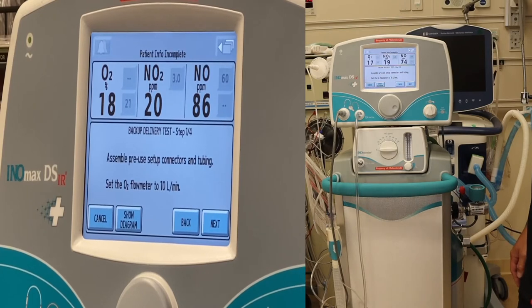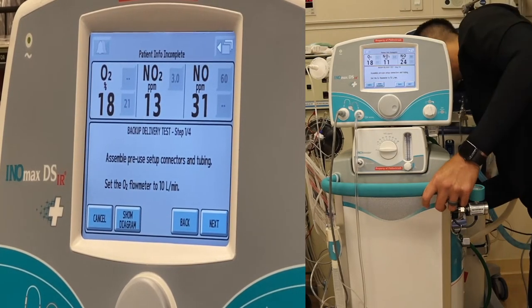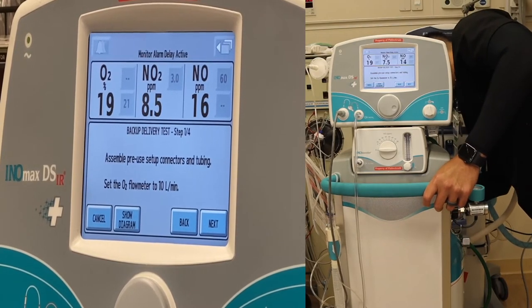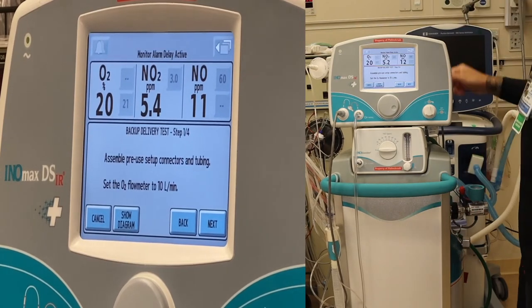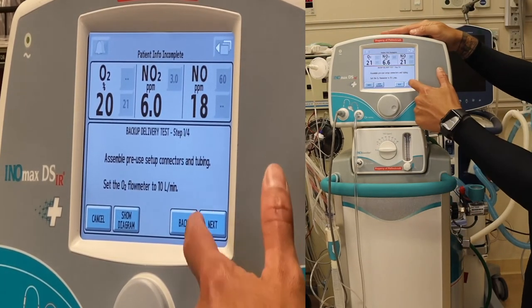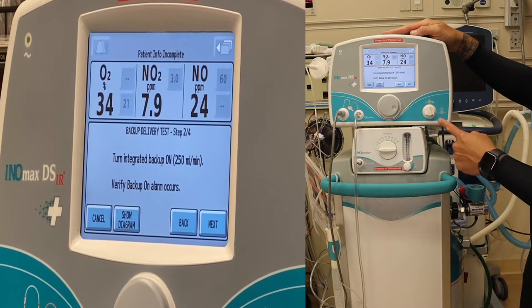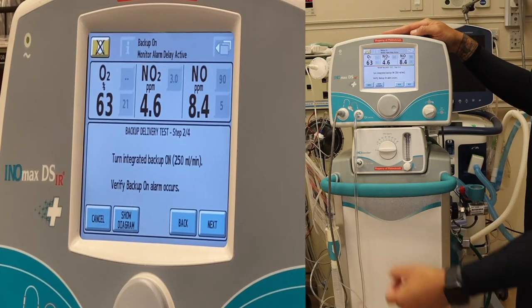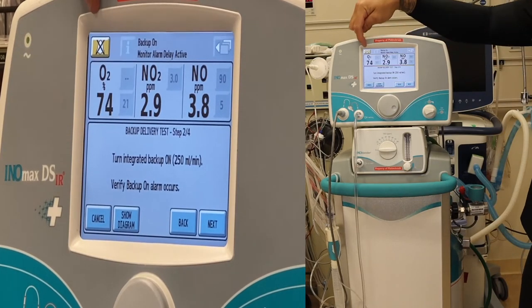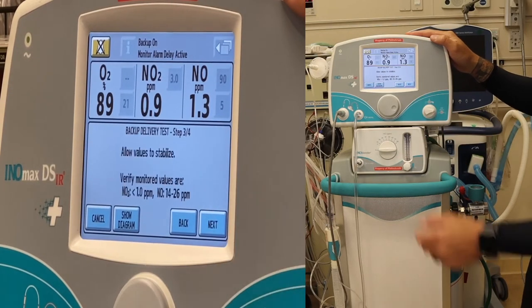Assemble pre-use setup connectors and set the flow meter to 10 liters. Set E-cylinder to 10 liters. Press next. Turn the integrated backup on to 250 mls per minute — found on the front, click that on. Verify the backup alarm occurs — you'll see the backup alarm went off in the top left. Press next.